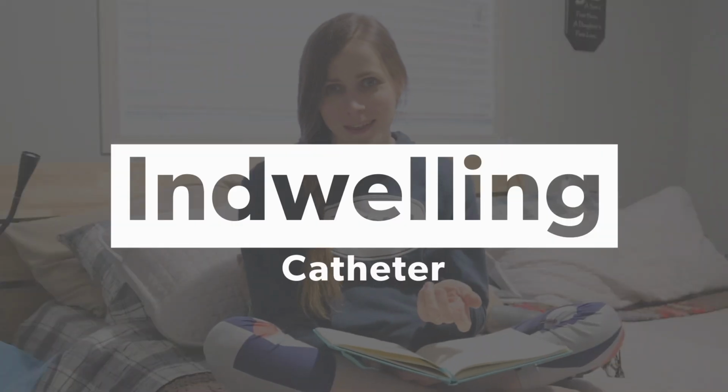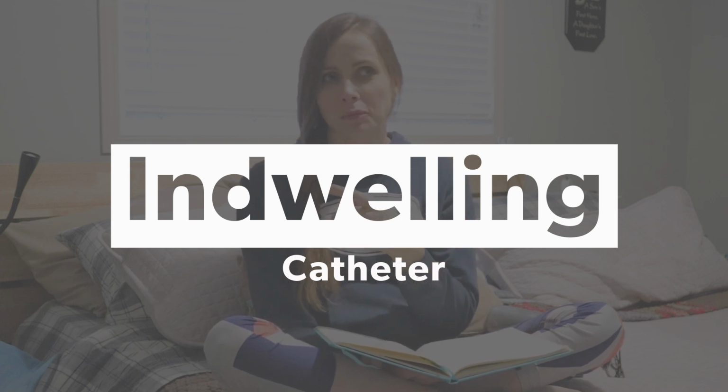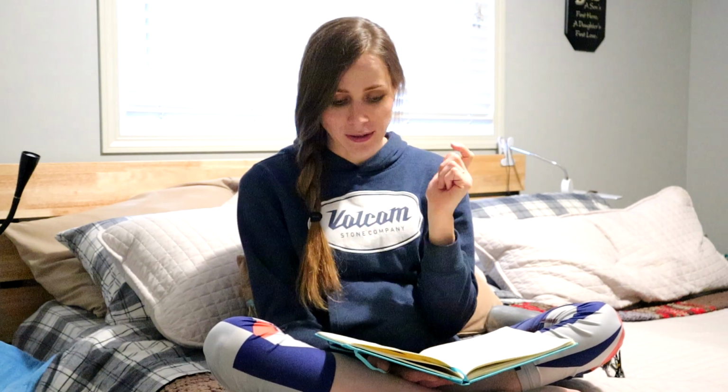Moving on to number 2. The second way to pee when you're paralyzed is an indwelling catheter, which is a catheter that stays in your bladder. Once you put the catheter in your bladder, then you blow up a little balloon that allows it to stay in there and doesn't pull out, and you're using your urethra again. So it's an indwelling catheter through your urethra.